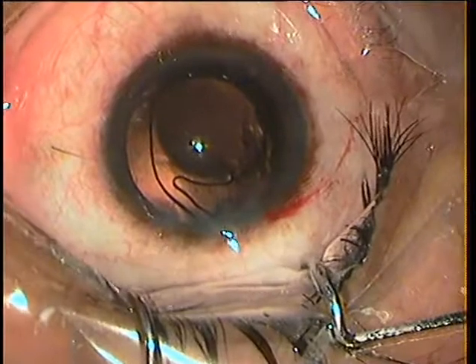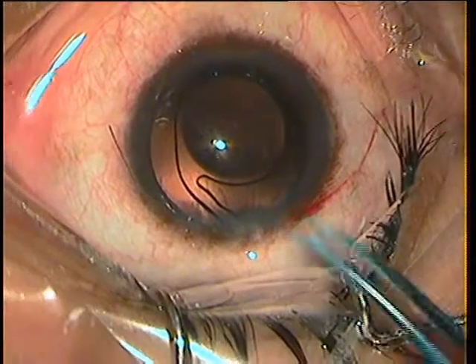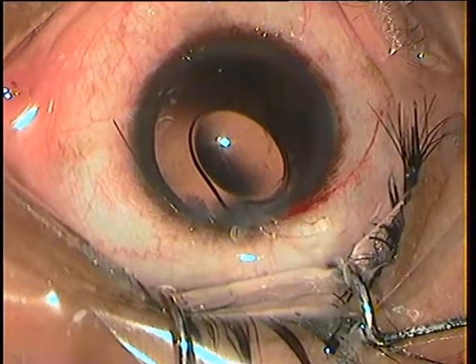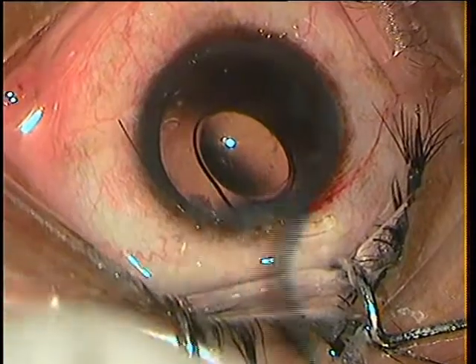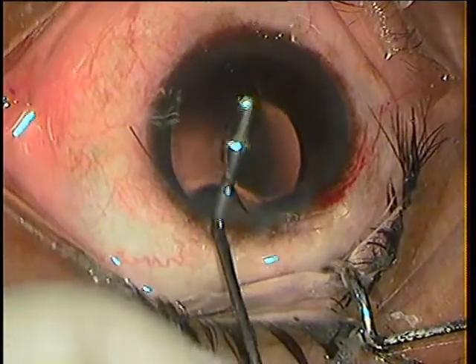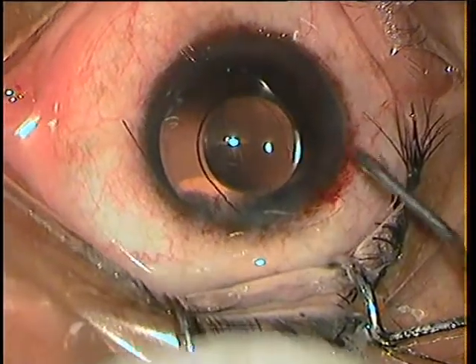My aim is to deepen the anterior chamber as much as possible and keep this lens as anterior as possible. I engage the haptic in the wound so that it doesn't slip back. I put in some more viscoelastic under it and lift the IOL totally out in front of the pupillary plane into the anterior chamber.